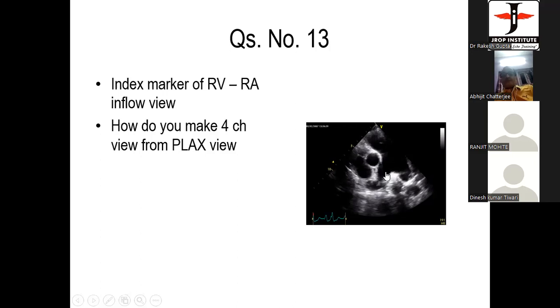Right, and so two branches of the pulmonary artery. What is this branch known as? Sir, this is the right pulmonary artery. Right pulmonary artery, and this is left pulmonary artery. And this is what? Sorry, sir, I don't remember this. Okay. Next person will come up.